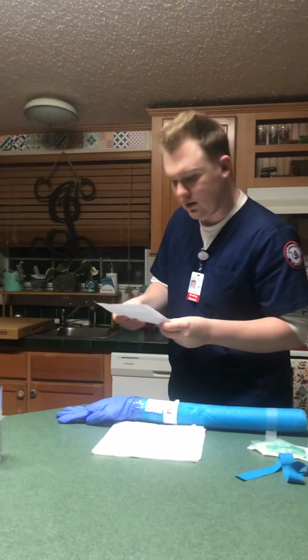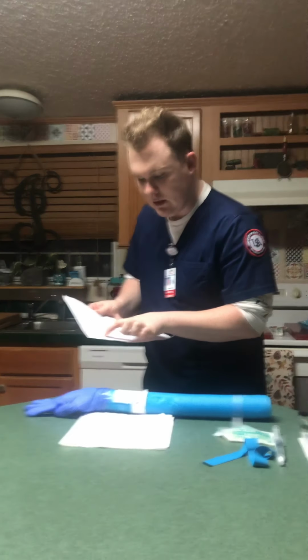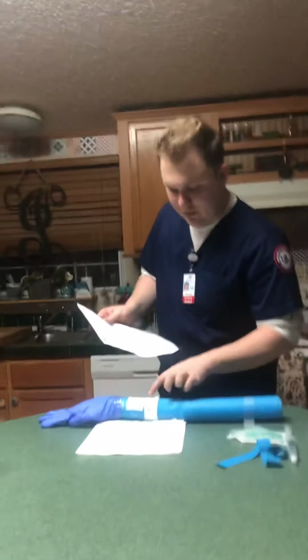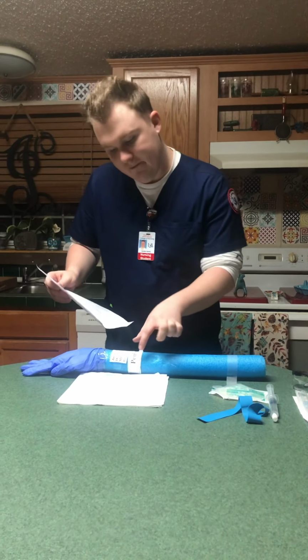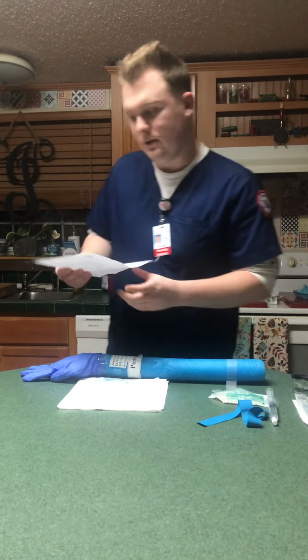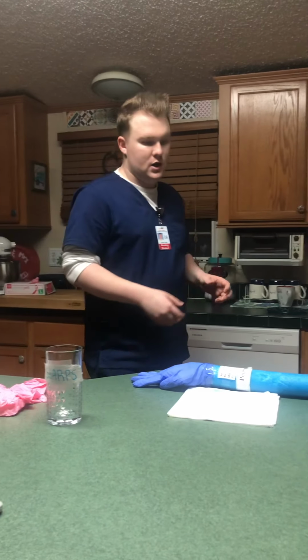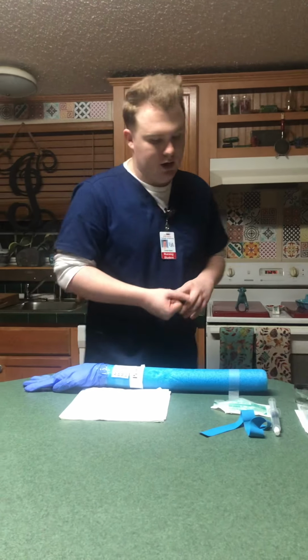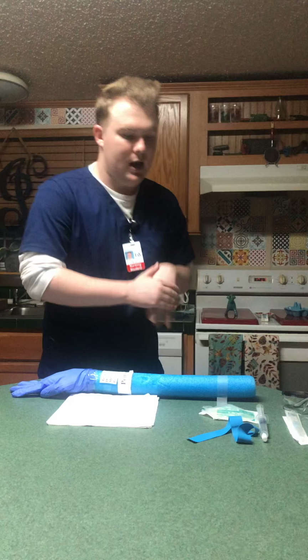Then I'm going to identify my patient using two patient identifiers. Jaguar Jones, medical record number 4176352. He's also allergic to penicillin, and that's verified by the armband that says penicillin. Mr. Jones, today I'm going to be inserting an IV on you, okay? Do you have any questions? No? Okay, good. I'm going to provide privacy, position my trash can, perform hand hygiene, and don my goggles.